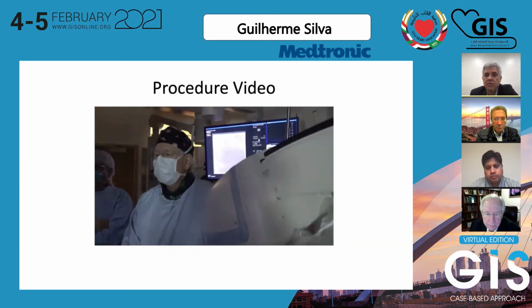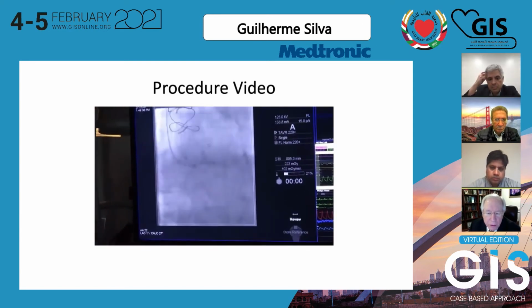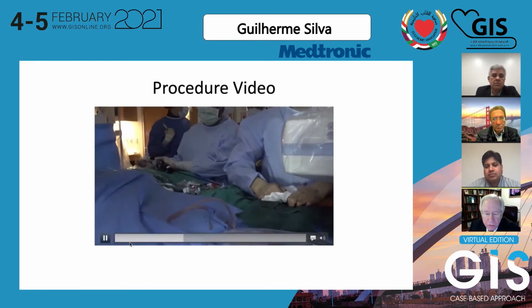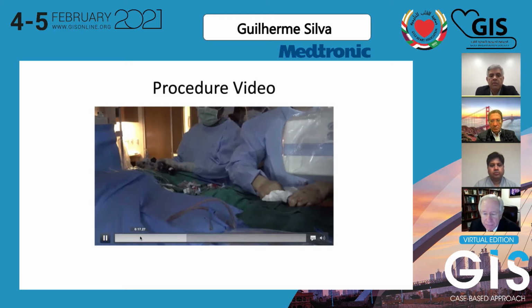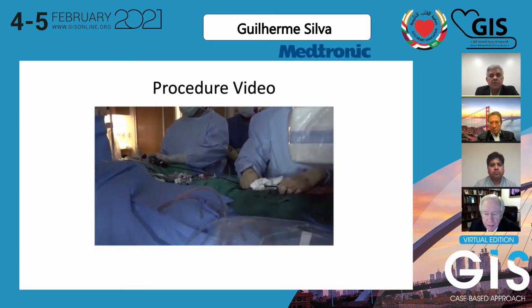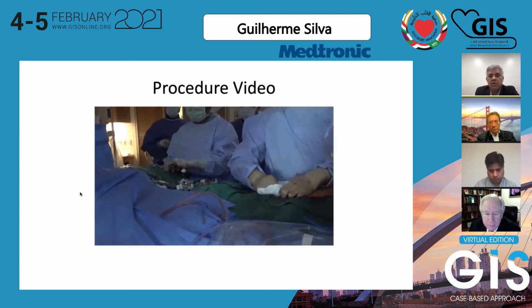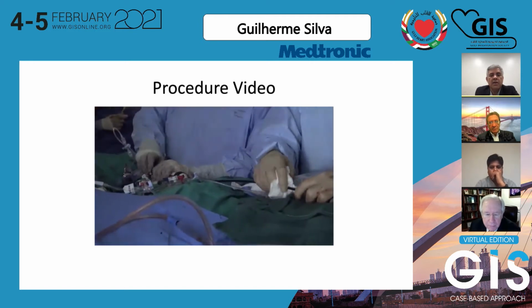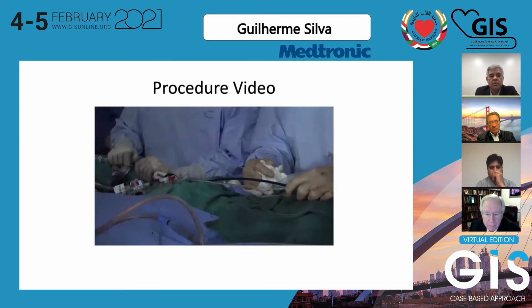Dr. Sell, in terms of crossing the valve, go ahead. Normally what we're able to do is just use the straight wire to get a feel for exactly where the flow is across the valve. Of course, that's the opening, and then you time it in systole and cross the valve. So we're putting the Edwards valve in, and this is a standard thing that we're all very used to. But here there was a little more difficulty because of the calcium, but we were able to traverse it nicely. Dr. Simpson is now mounting the valve in the descending aorta as usual.